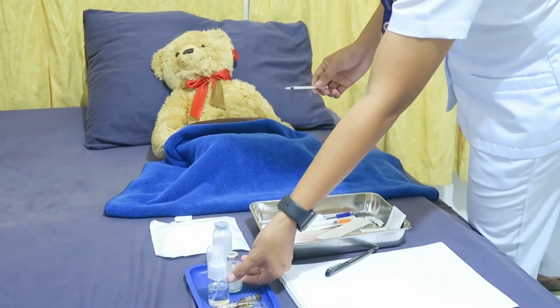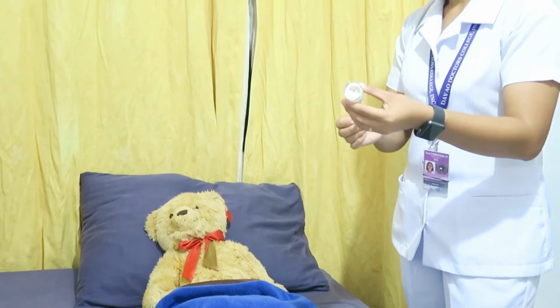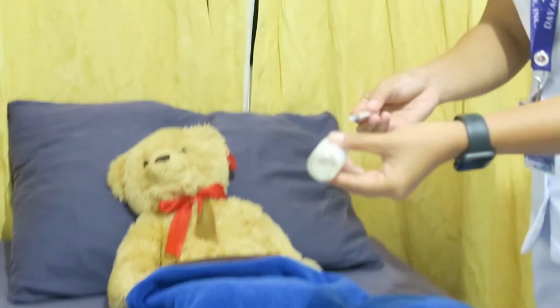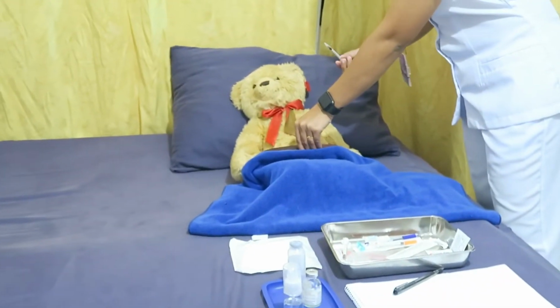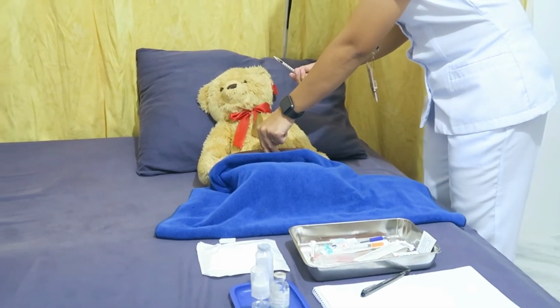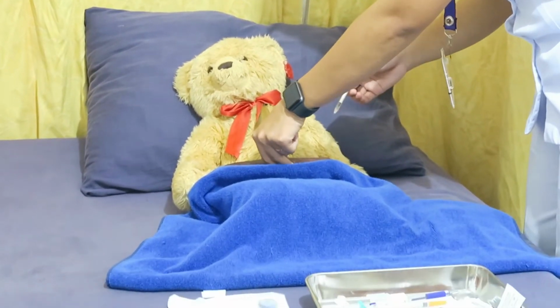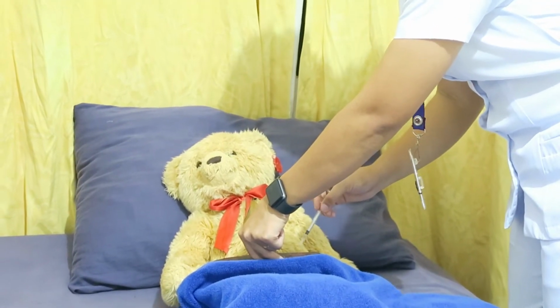So, let's inject this medication. The rationale for that is that rapid injection may cause discomfort. Pain is minimized by inserting the needle without hesitation. So, let's insert the needle into the abdomen or the side of the patient.